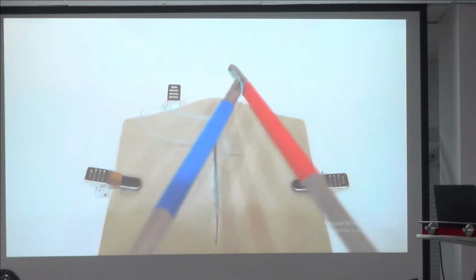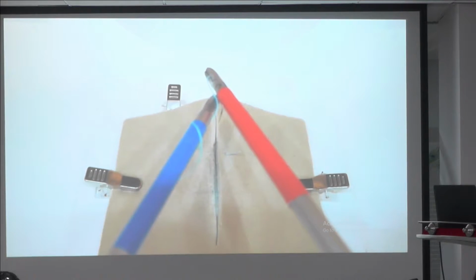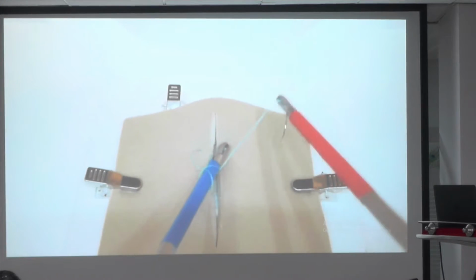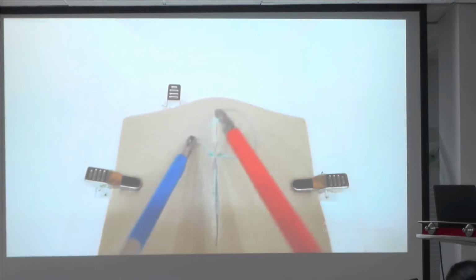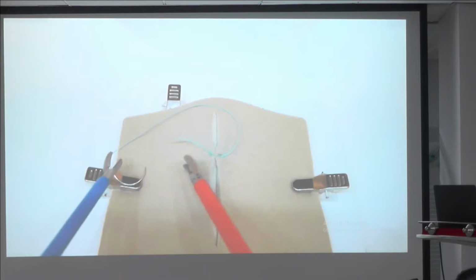For procedures such as laparoscopy or appendicectomy, we use the same for both if you do it on the organ within the training box or if we do it on virtual reality, because it is complementary with what the system has registered.